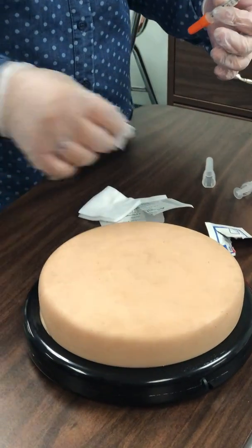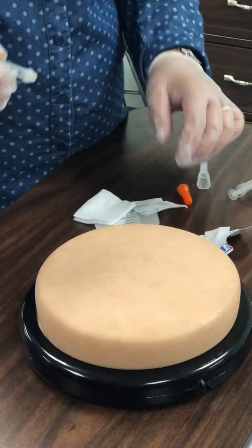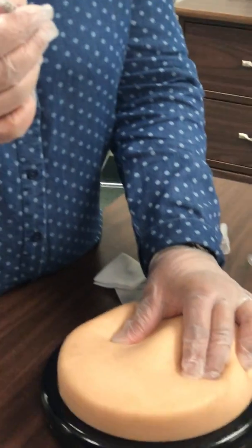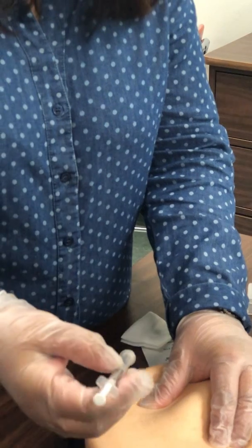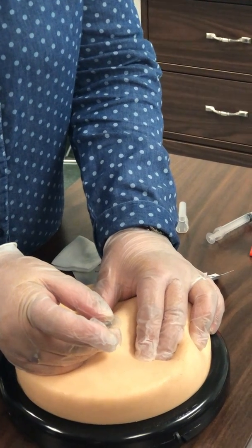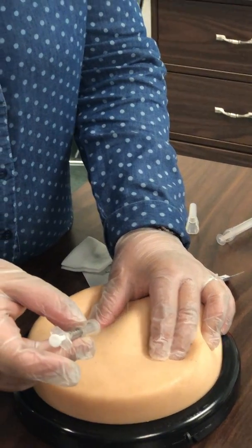About 2 inches, all right? Wait for it to dry, and then we will pinch, all right? I will pinch. Okay, so bevel up. You look for the bevel. It has to be bevel up, all right? Bevel up, and then we go like this, and then we push the medicine in, and then we just go out the same way.